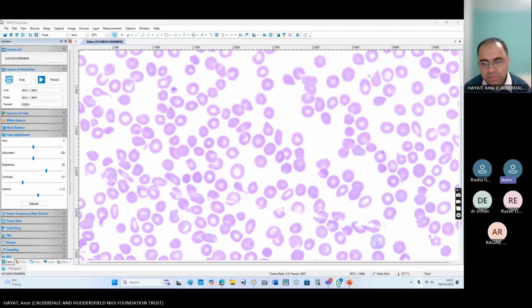So in general, for exam purposes and also for real life, if someone tells you that this patient is progressively anemic and has splenomegaly as well, I would think about two differentials on the top: either myelofibrosis or hairy cell leukemia. I need a blood film to see what the picture is. If he has teardrops, likely myelofibrosis.